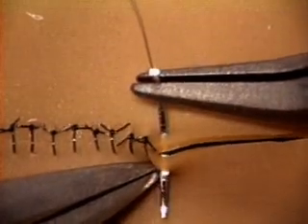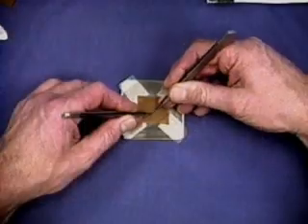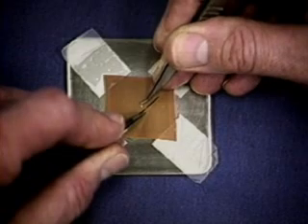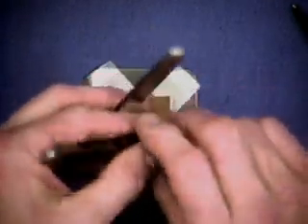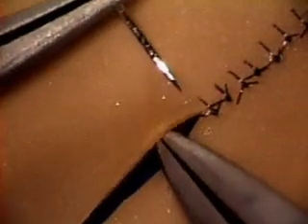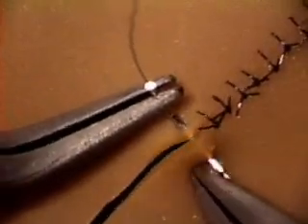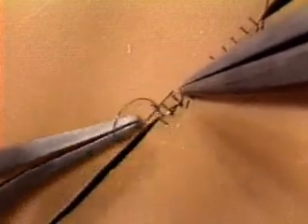Straight up and down, straight across, and backhand. This is the hardest position to master. Learn to do good backhand stitches, passing the needle not only toward yourself, but also away from yourself. Lastly, practice being ambidextrous. Convince your non-dominant hand that it can be a successful prime mover, and convince your dominant hand that it can sometimes just be the helper.